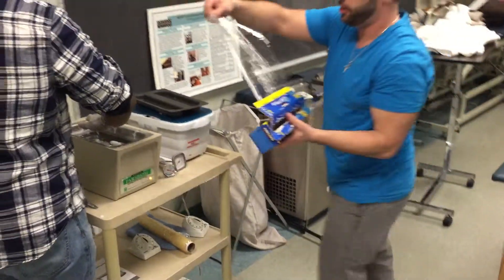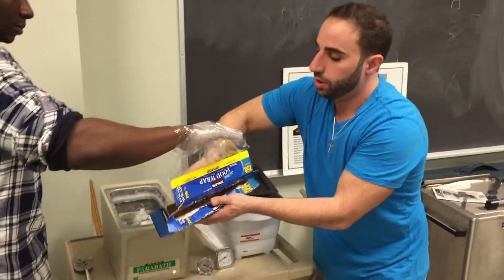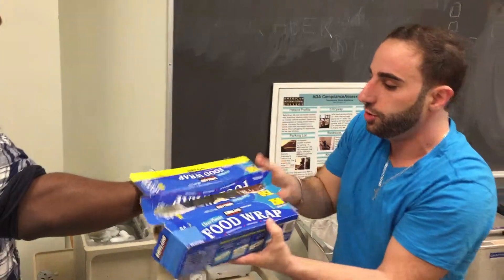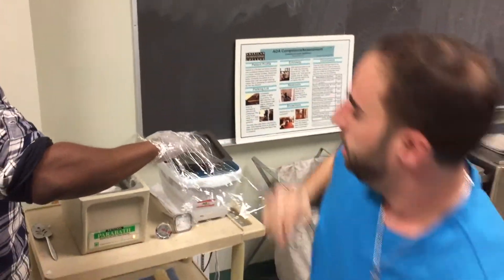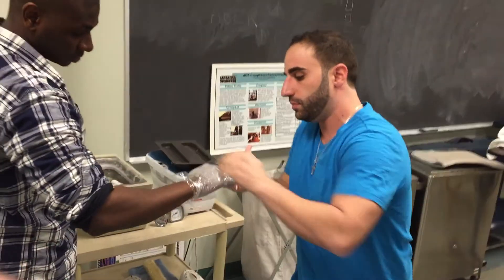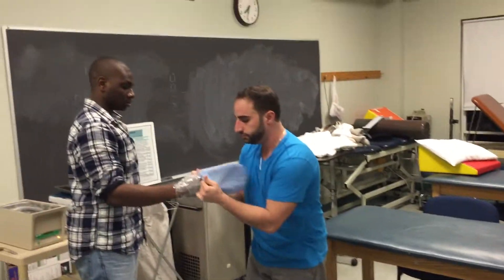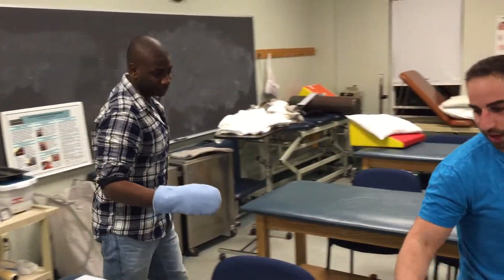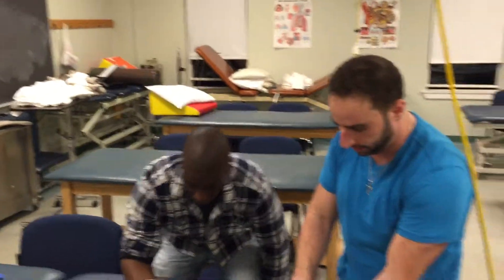After dipping eight to ten times, you're going to wrap the hand in one quick layer of saran wrap to hold in the heat. Then have the patient put on a glove and sit down comfortably with their arm rested. Set the timer for 12 to 15 minutes, which is the appropriate amount of time to leave it on.